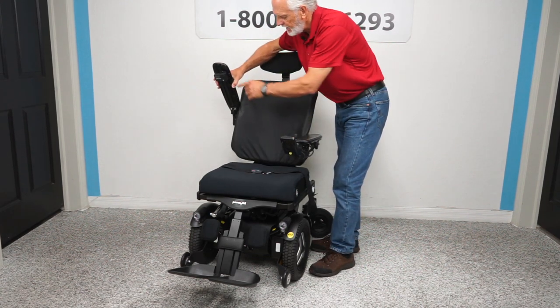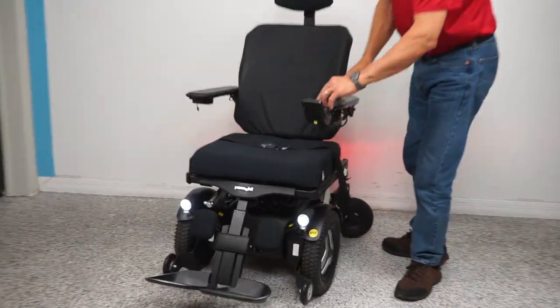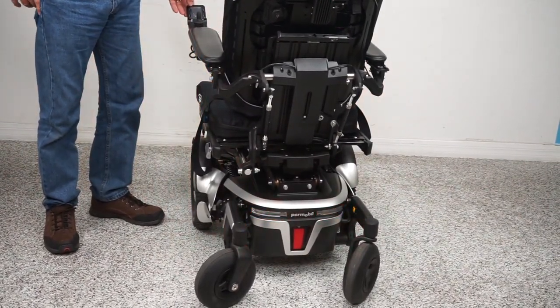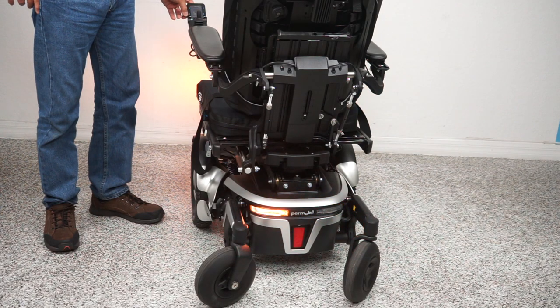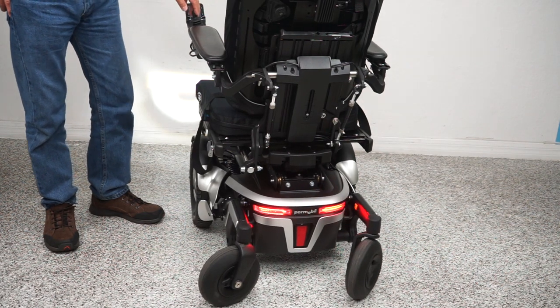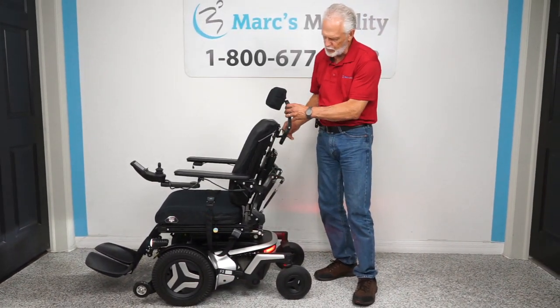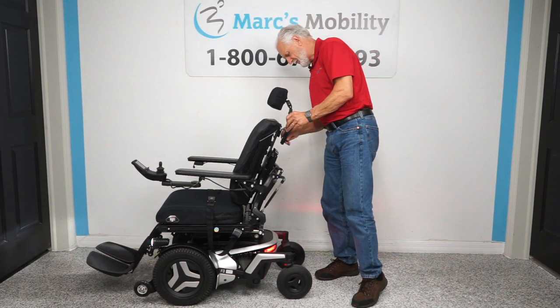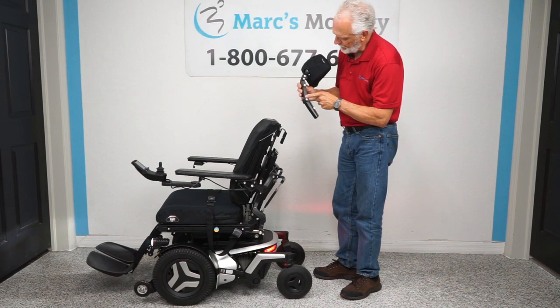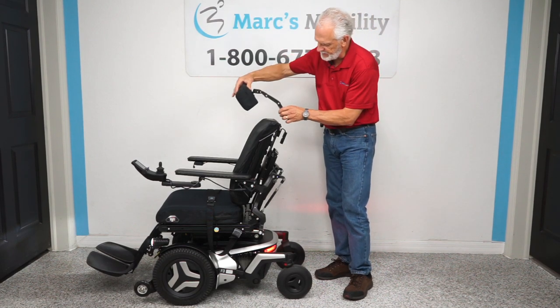It has a safety belt, a USB port to charge your phone, and factory headlights and tail lights. It also has hazards, a left flasher, and a right flasher. So this chair is equipped with lights from the factory. The back has a fully adjustable headrest that can be removed. You can see there are multiple adjustment points, and you can adjust the headrest to any position you want.